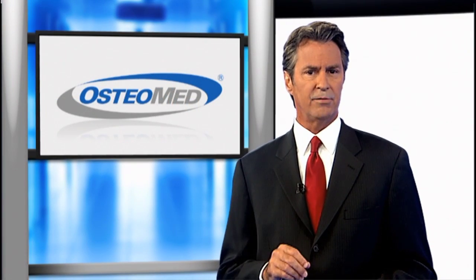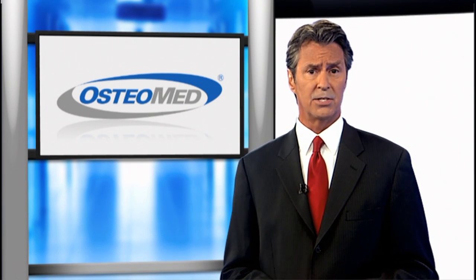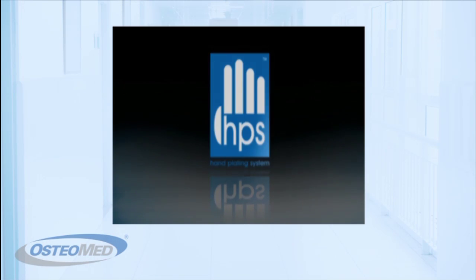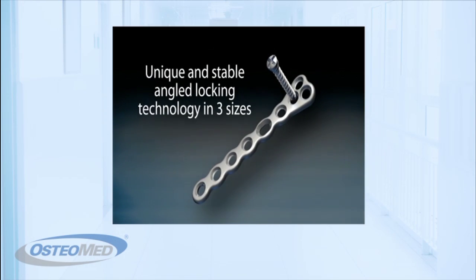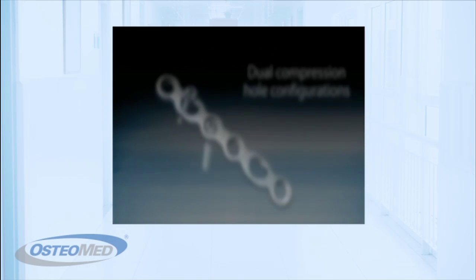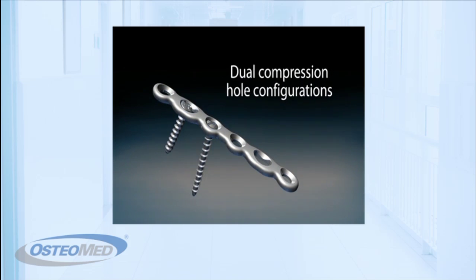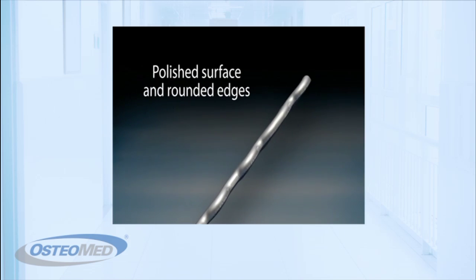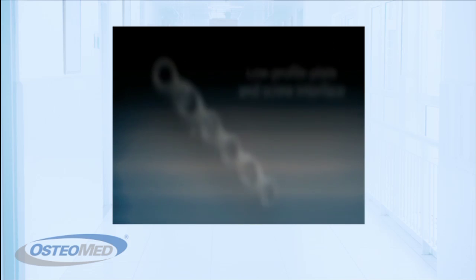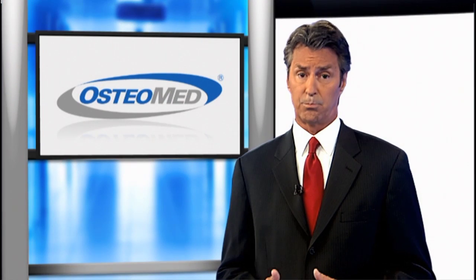Osteomed, a leading global innovator, developer, manufacturer, and marketer of specialty medical devices, has created the comprehensive hand plating system. This versatile system provides five different screw options and about 50 different plates, which allows for numerous intraoperative options to help you best treat the personality of the fracture. In addition, this system allows you to use both non-locking and variable angle locking screws in the same plate, as well as both solid and cannulated lag screws for compression options.